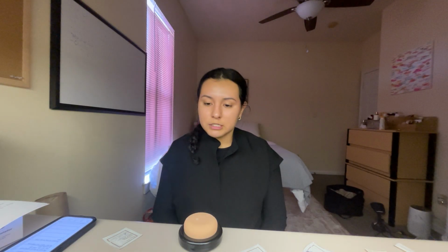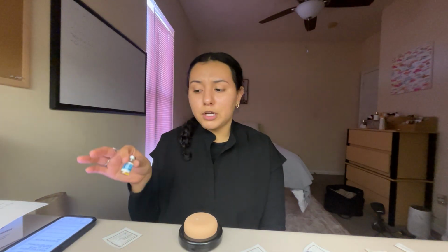After I do this, I would remove my gloves. I would discard all of my supplies. The Demerol would also go in the sharps container since it is a narcotic, and we would document all of our medication that we administered into our MAR.